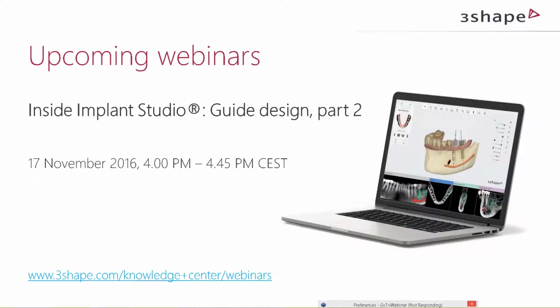Okay, looking through more questions. One more question that I have in here: which brand gives a multi-unit abutment possibility? At the moment, like I said, we have only one, and that's the Biodental library. But most probably very shortly we will have more coming up.